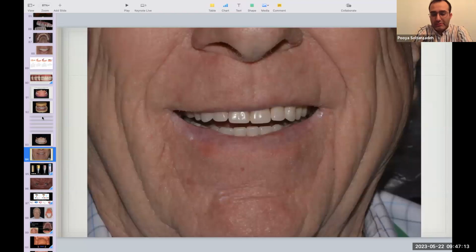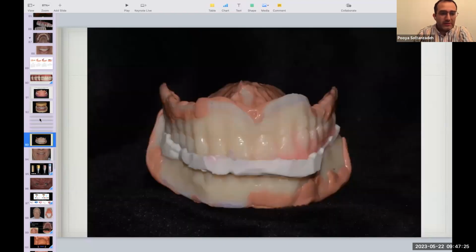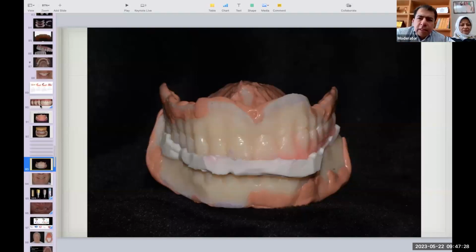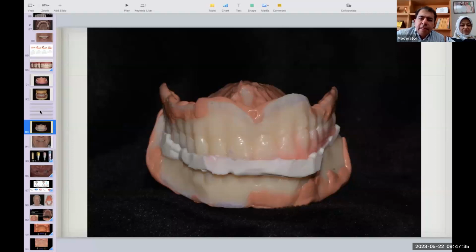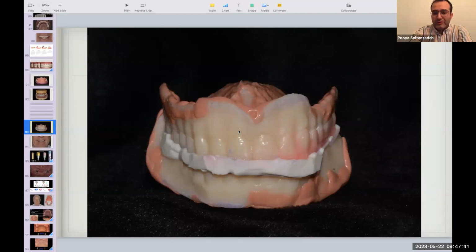The patient has some lip asymmetry when he smiles, the upper left lip lifts up a little more, but now everything is super parallel to the interpupillary line. This is one of the things that you can do. This is a kind of complication we face during the trial, and you can adjust it easily. Yes, it's super easy. And in order to avoid paying them, if you have a 3D printer in your office, they can send you the STL file of this trial denture. You can 3D print it in your own office, try it in the patient's mouth, and then send everything to them.